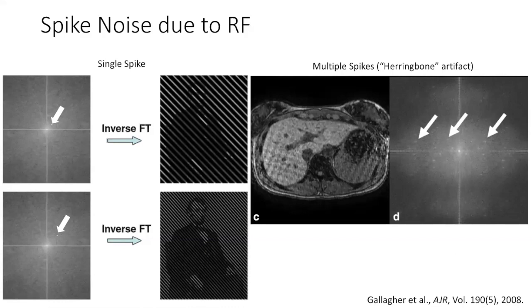This one, again, you just want to make sure that the RF shielding and the door is closed and all that, and there aren't any sparks or other electronic devices that could affect your scanning during the data acquisition. If you ever see a spike like this, where you have this bright intensity in one of your K-space pixels, I think you can just set it to 0 to get rid of it, and hopefully you'll still get the image you expect. But this comes about.